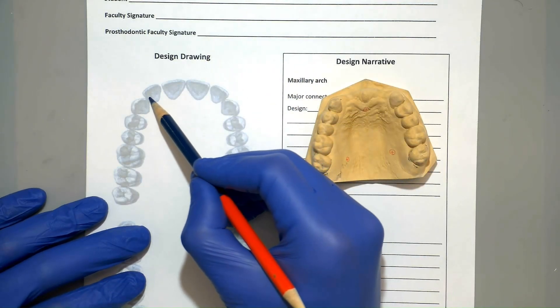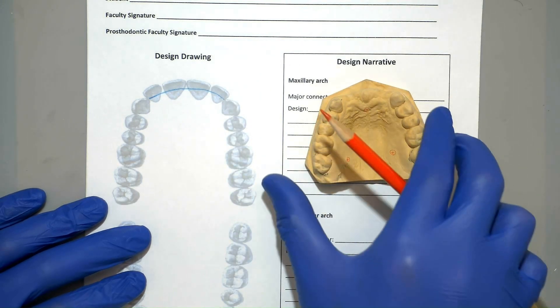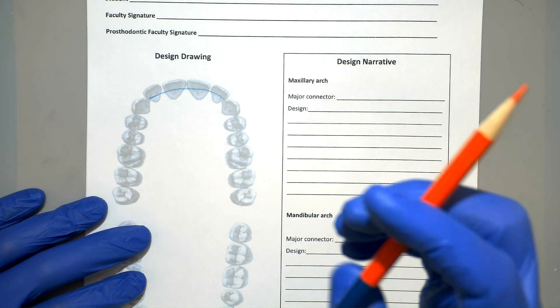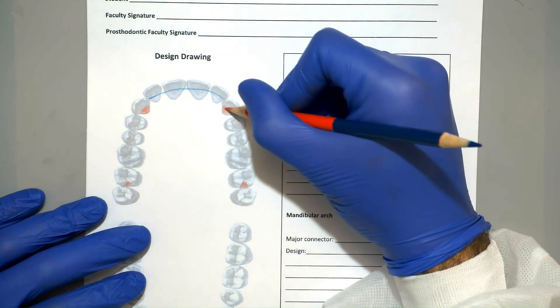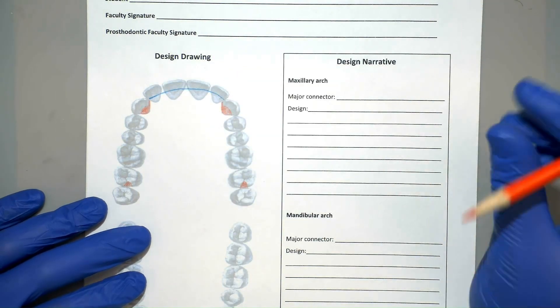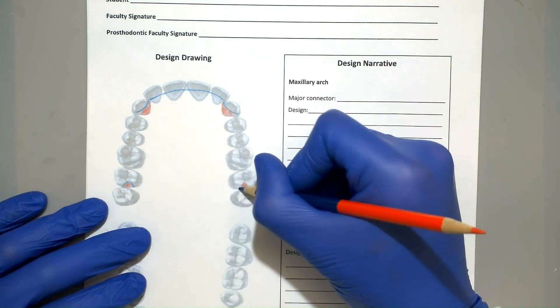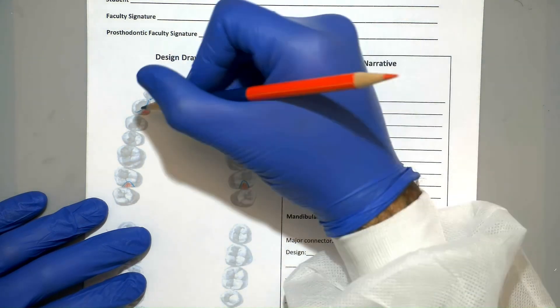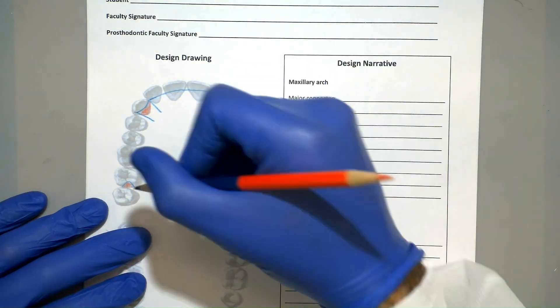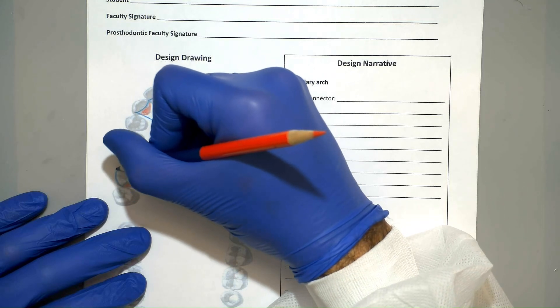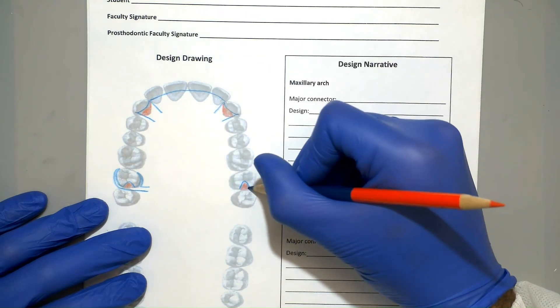Now we're going to go ahead and draw our design on paper. I use the cast to identify which teeth are missing and mark them with a blue line going through the center of the missing teeth. Then use a red pencil to draw all the different rest seats on all the abutment teeth. We'll switch over to the blue pencil and draw the rests over the rest seats in blue. We'll also start extending some minor connectors and drawing the cast circumferential clasps, extending minor connectors from those as well.